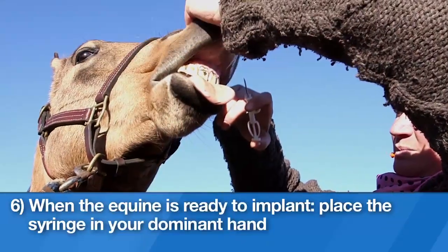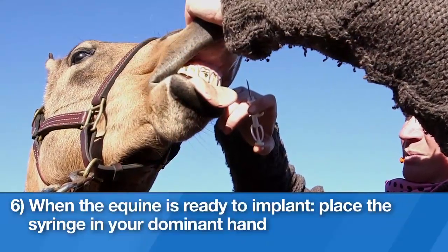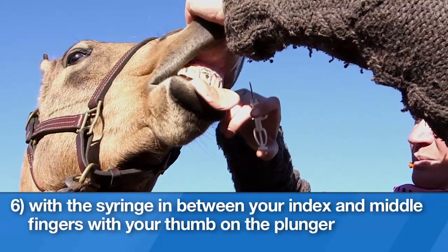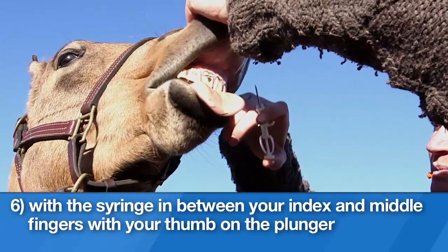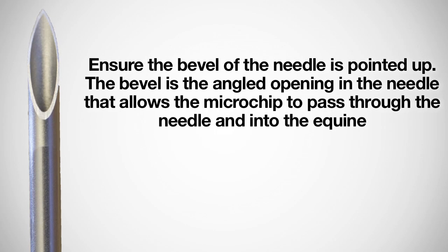6. When the equine is ready to implant, place the syringe in your dominant hand with the syringe in between your index and middle fingers with your thumb on the plunger. Ensure the bevel of the needle is pointed up. The bevel is the angled opening in the needle that allows the microchip to pass through the needle and into the equine.